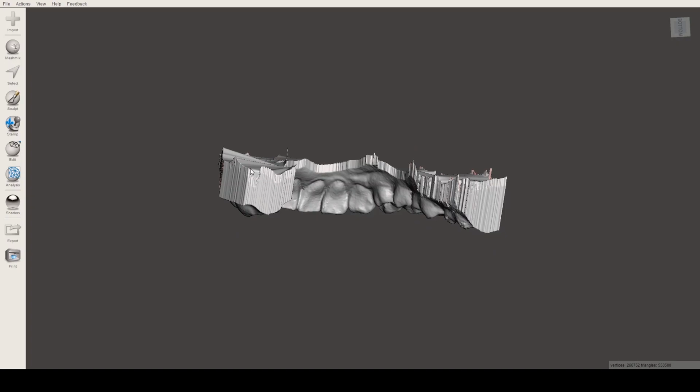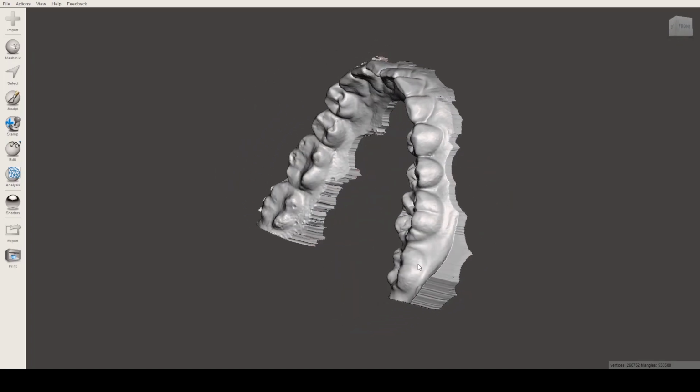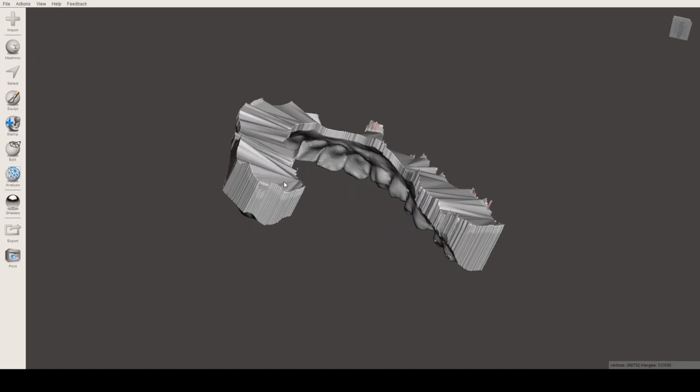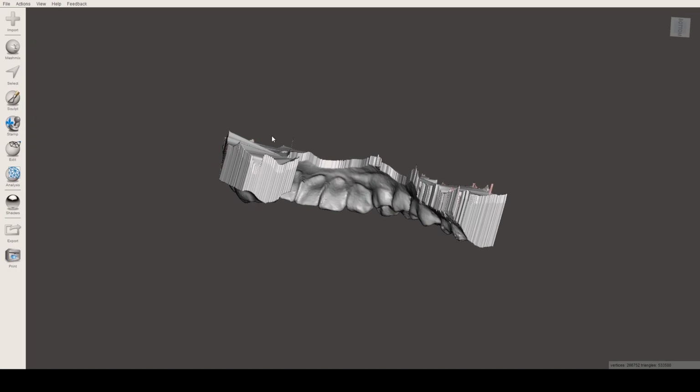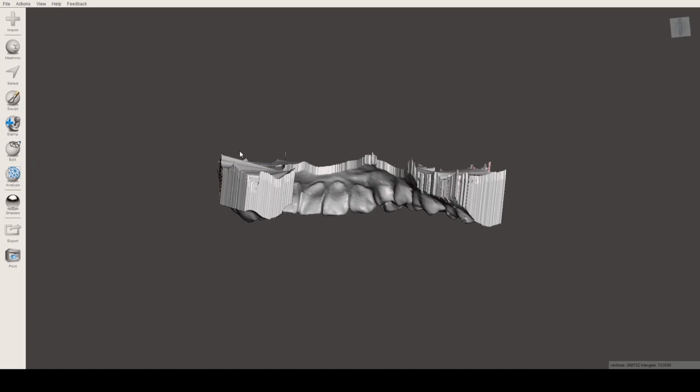What I like about Meshmixer is it just has few buttons, unlike other software out there which has a bunch of buttons and you end up not really using them. In this case, we're just going to work with the basic functions of Meshmixer itself. So we have here the import button, the mesh mix button, select, sculpt, stamp, edit, analysis, shaders, export, and print. We're not going to go through print today because I don't own a 3D printer.